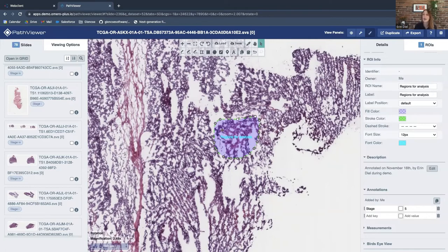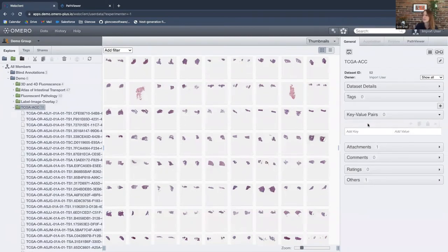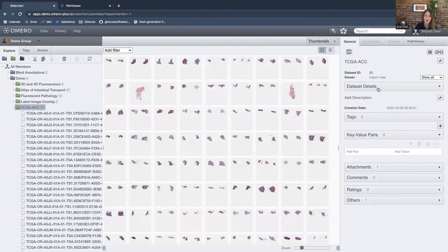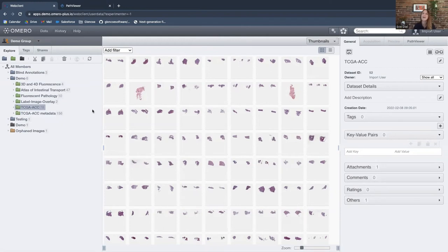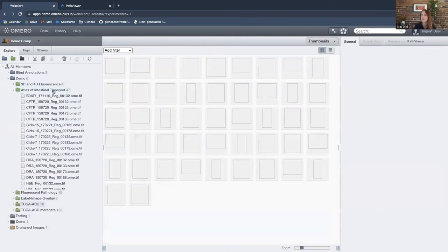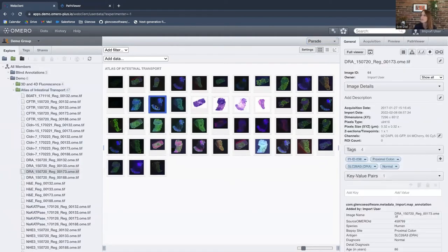This is a great way to assign metadata at the right level within the hierarchy. You might have clinically or experimentally relevant metadata attached to the image itself, while other metadata applies specifically to a particular ROI — like staging information specific to a tumor region. Similarly, in OMERO Web you can attach metadata at the dataset level. Now I want to dig a little deeper into using image-level metadata to find the images I want to look at or annotate. Rather than picking an image at random, I'll use an application called OMERO Parade.